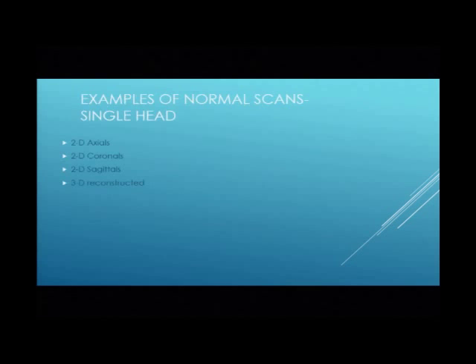When somebody has a concussion and the head and the neck is going back and forth and the brain is rocking and rolling inside, it's actually getting pushed up against the skull. And the brain is a very delicate substance, and it doesn't like getting hit up against bone. So the 3D turns out to be very important to see the surface of the brain where the injury is the worst.